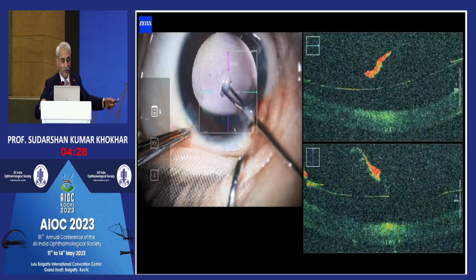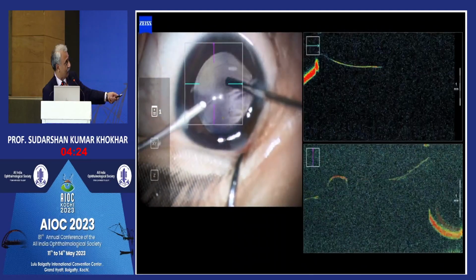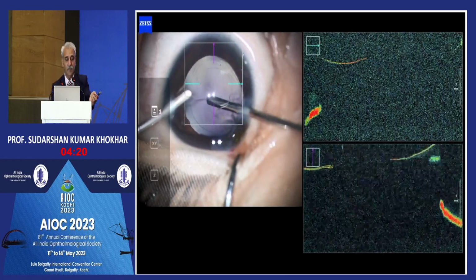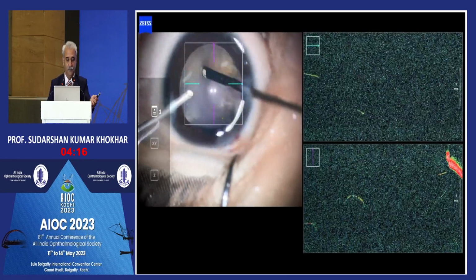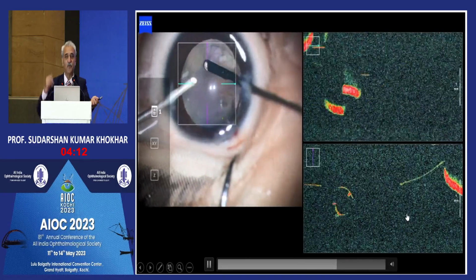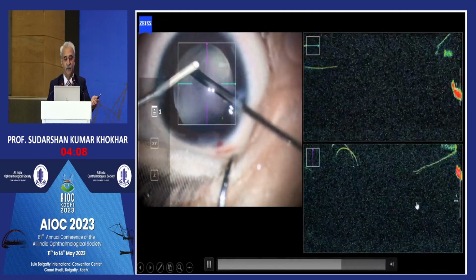Okay, so see, I've got this plaque up and the capsule was not open. And then once you open the capsule, we do the vitrectomy, you can see the opening. And now you can make out the layers quite clearly. So this was a patient in which the membrane at the back, the posterior membrane, was not one layer, it was multiple layers, and that we could pick up and manage it.